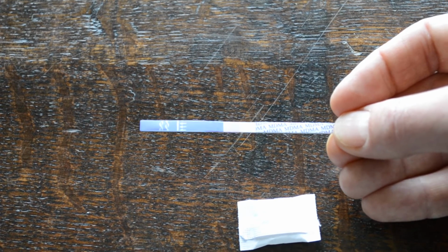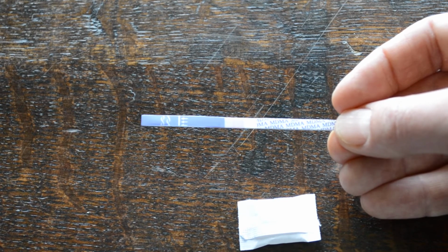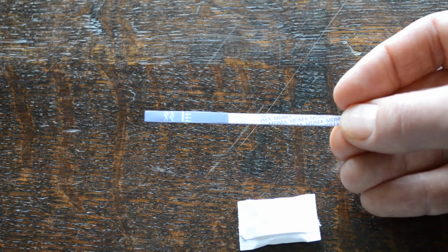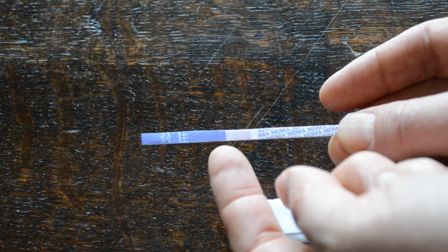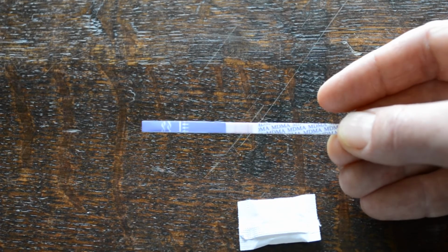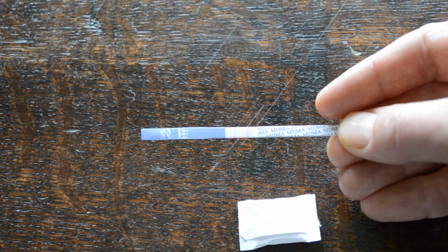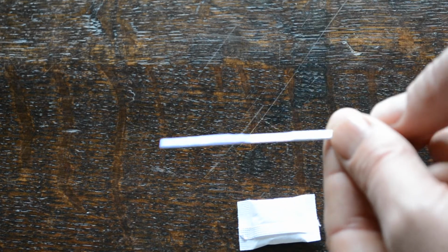Now these are standard format in terms of the interpretation of your results. You're looking for the development of a control line which develops approximately 5 millimeters away from the base of the MDMA coding here, and then the development of a test line that forms, and you can see it developing already here before the control line's developed, of the test line approximately 5 millimeters from the dipped urine end where the colour banding ends and the white central narrow portion shows.